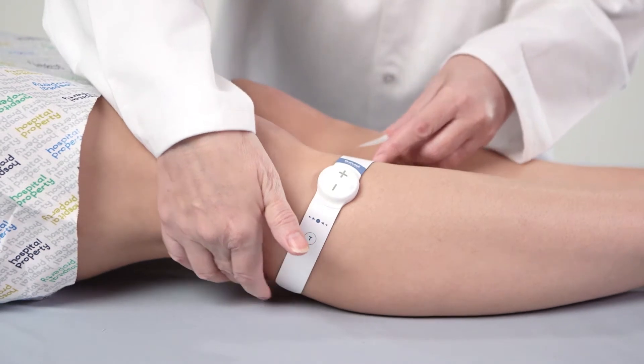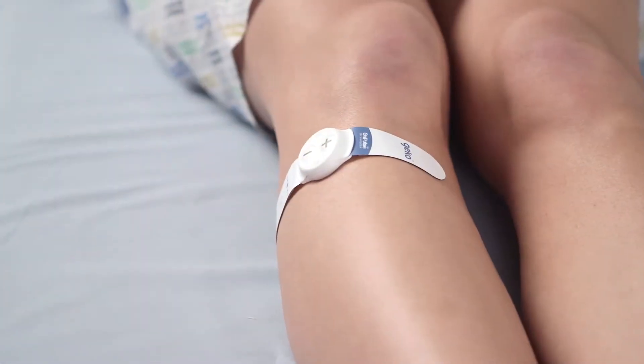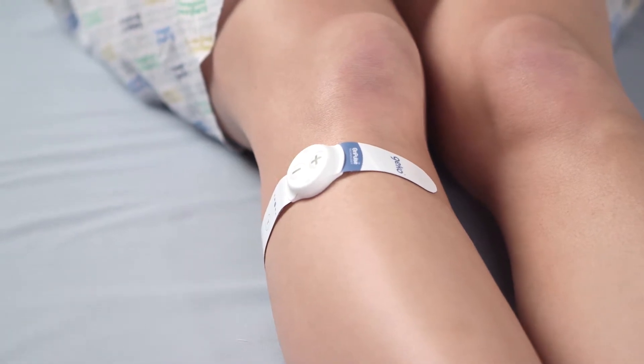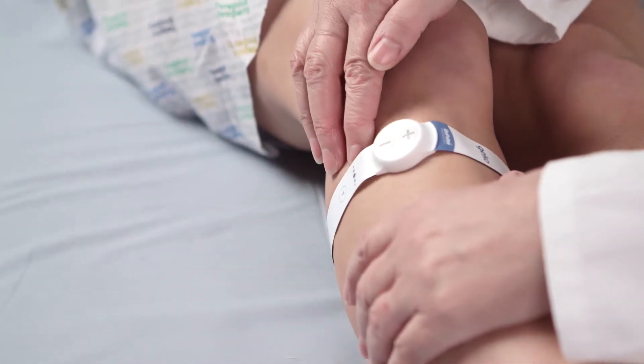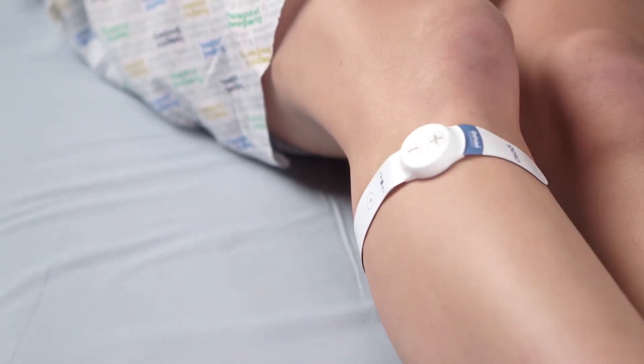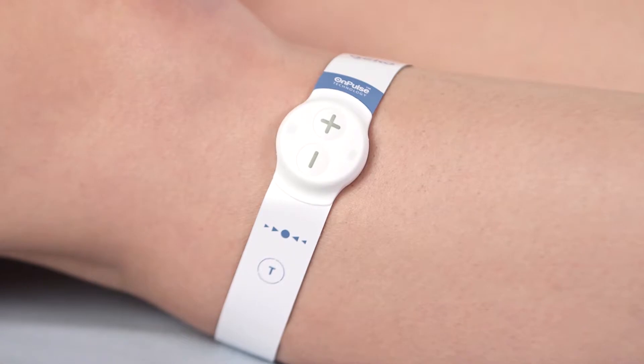Correctly fitted, the branded short end is positioned to the front of the knee, with the long end wrapped around to the rear of the leg, below the crease of the knee. This will place the negative electrode over the common peroneal nerve and will position the plus button to the front of the leg and the minus button to the rear, whichever leg the device is applied to.